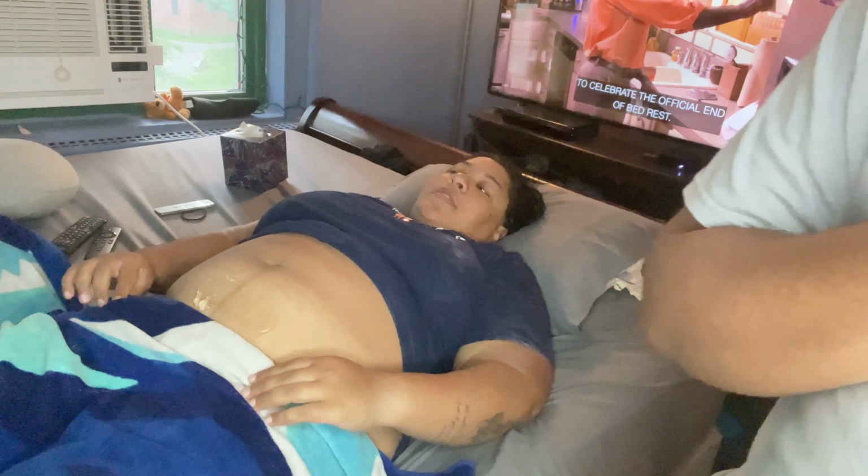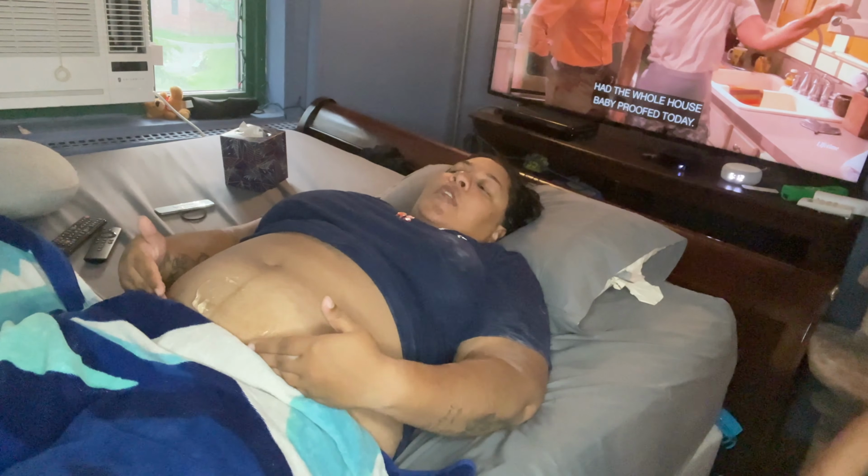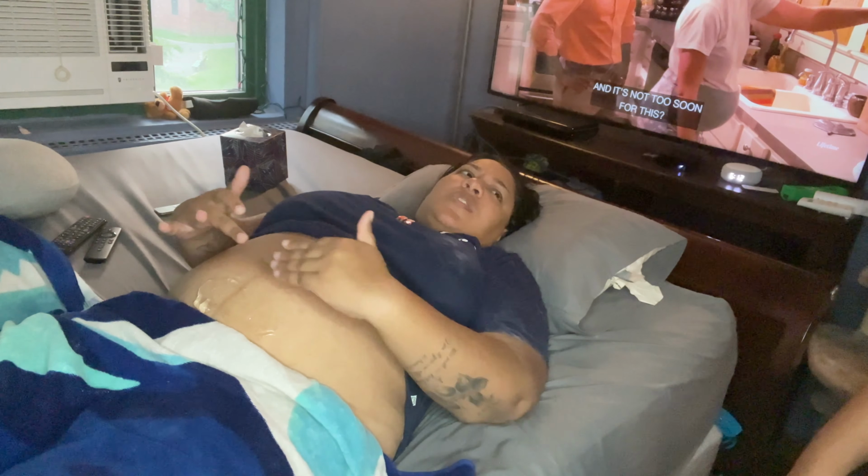Also keep in mind that where you'll find the baby depends on how far along you are and the size of your body. Usually I was able to find him right by my pelvic bone. But now that I'm at 20 weeks and further, he's around just below the belly button, usually about 2 inches below the belly button.